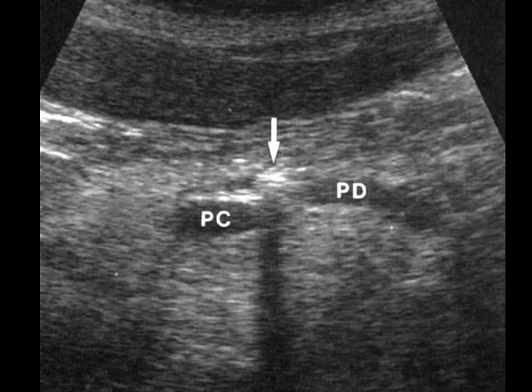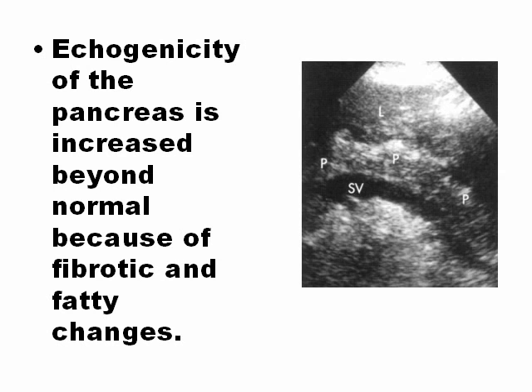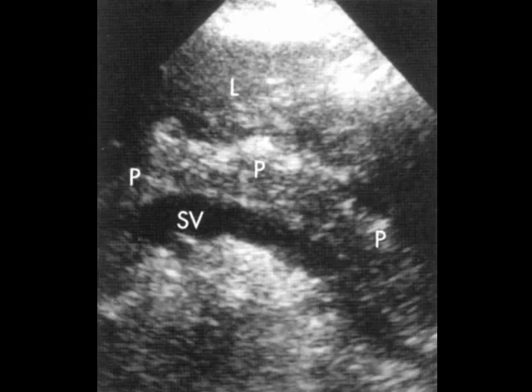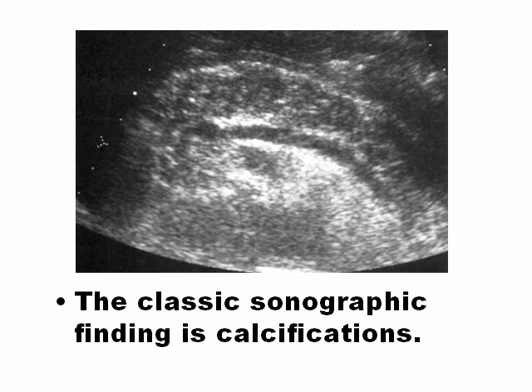You can also see the dilatation of the pancreatic duct. Echogenicity of chronic pancreatitis is increased because of fibrosis and fatty change. In ultrasound, chronic is hyperechoic and acute is hypoechoic. This is a typical ultrasound of chronic pancreatitis. The classic sonographic findings for chronic pancreatitis are calcifications.